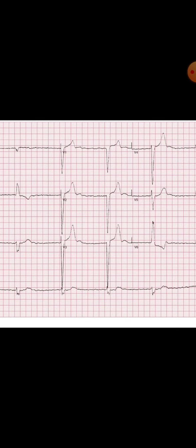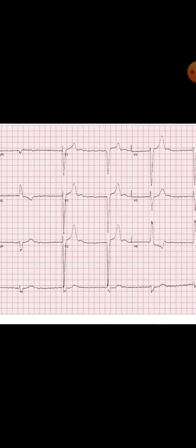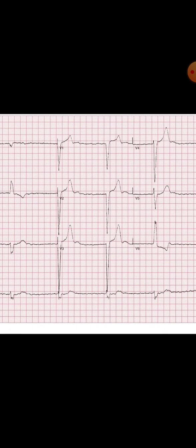It actually means that the patient is having atrial fibrillation but along with it the patient is also having third degree heart block, or complete heart block, or AV dissociation. So this is an ECG of atrial fibrillation plus third degree heart block.